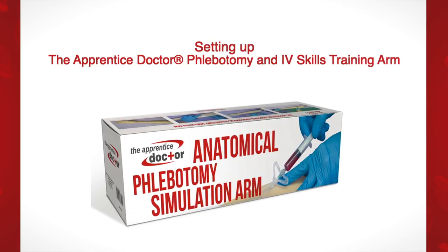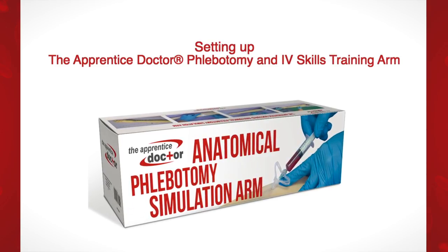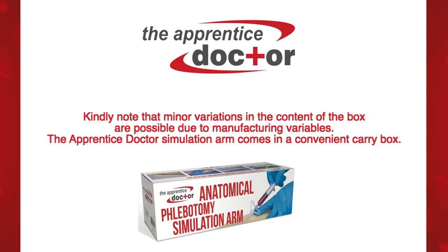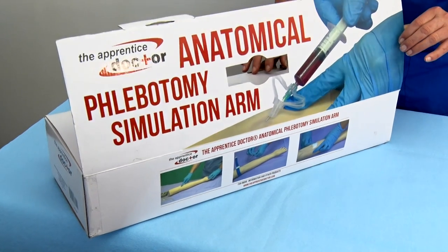Setting up the Apprentice Doctor Phlebotomy and IV Skills Training Arm. Note that minor variations in the content of the box are possible due to manufacturing variables. The Apprentice Doctor Simulation Arm comes in a convenient carry box. Unboxing the arm is quite easy.